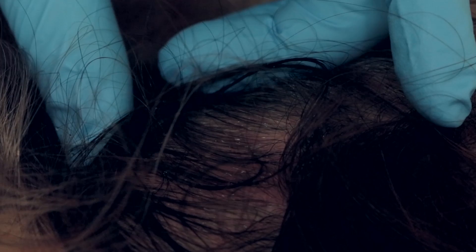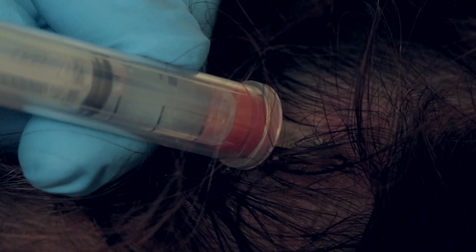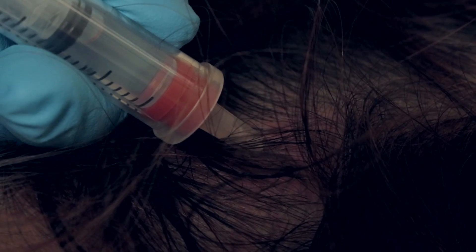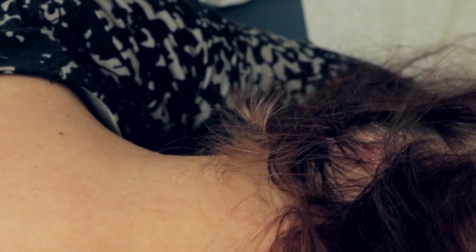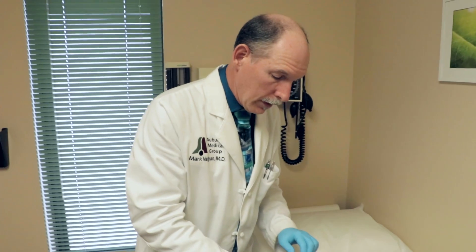Some people that will be their tender spot. I'm going to give a shot there — draw back to make sure there's no blood, then start to inject. She says she feels that one. Fanning it out — yes, that's where it hurts. We may have to do that also on the other side. There's a little bleeding with that one, so I'm pushing it in and working the anesthetic in.